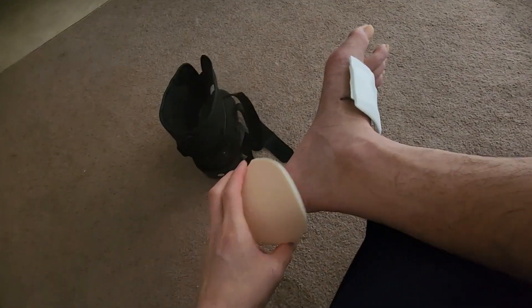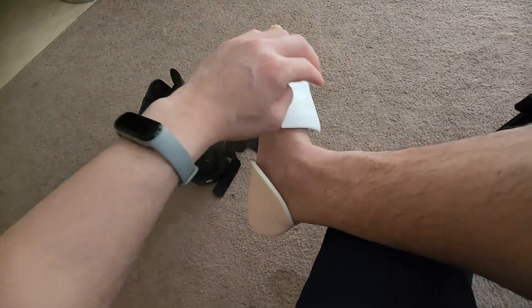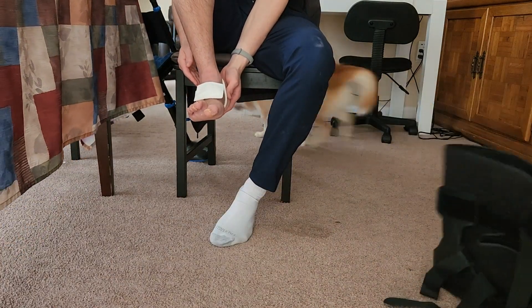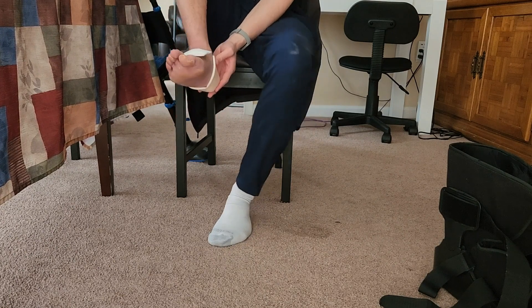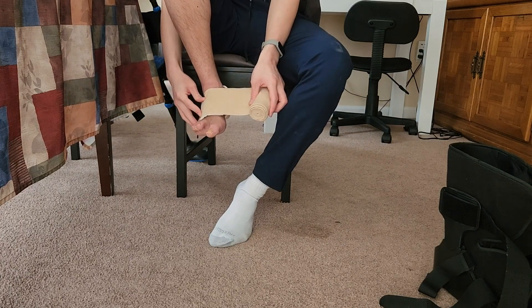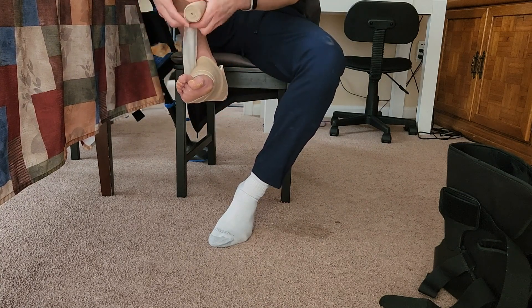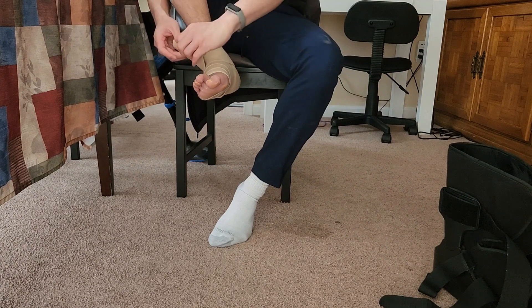The heel pad I got off Amazon, though some CVS or Walmart locations may carry it. See how it fits right on the heel. Now with everything in place, I'll wrap with the bandage. Make sure there are no wrinkles in the wrap, because wrinkles can actually cause more pressure ulcers. Keep covering and smoothing as you go.